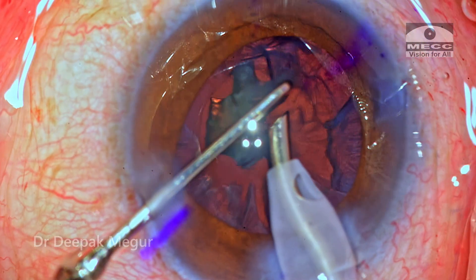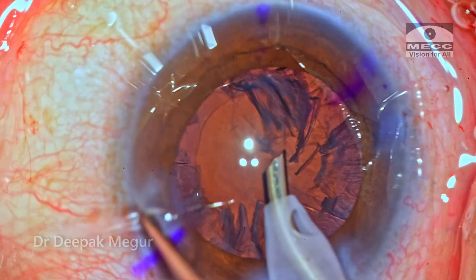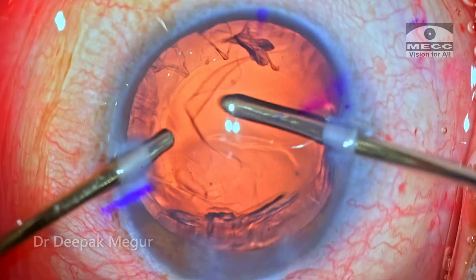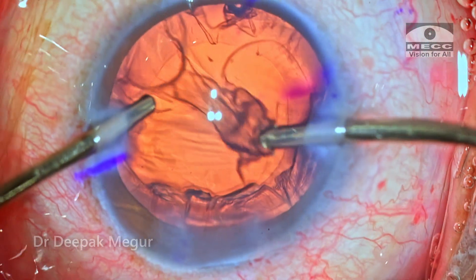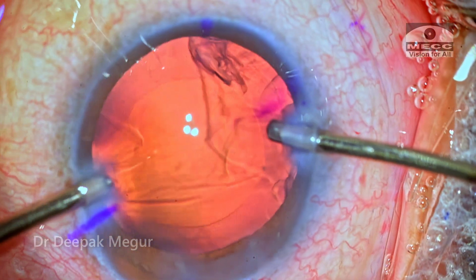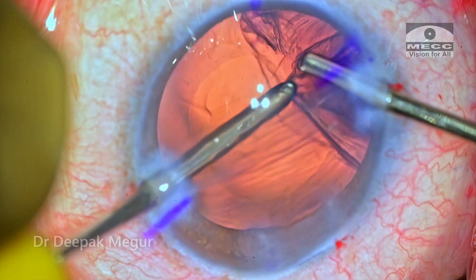Once the fragments are emulsified, it's time to remove the cortex. Usually the patient complains of pain whenever we come out and re-enter the eye. These are the times when we need to go in with very low bottle height, and once we are inside, we can gradually increase the bottle height to whatever is necessary. Sudden deepening is going to cause more pain in these myopic eyes, and this is the strategy which I follow.